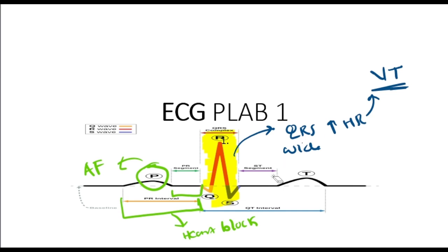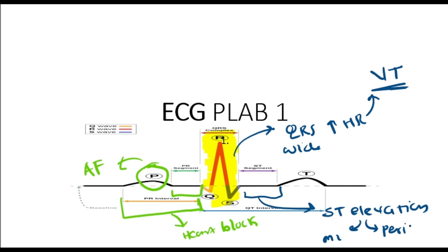Then we have the ST segment here, and this is ST elevation, which means we have MI, pericarditis, and some other conditions, but our main focus will be on MI localization.